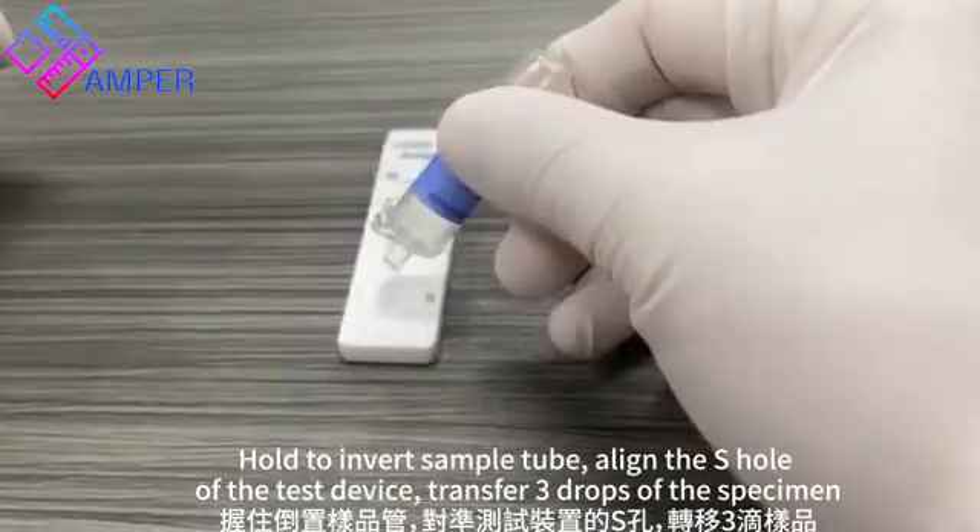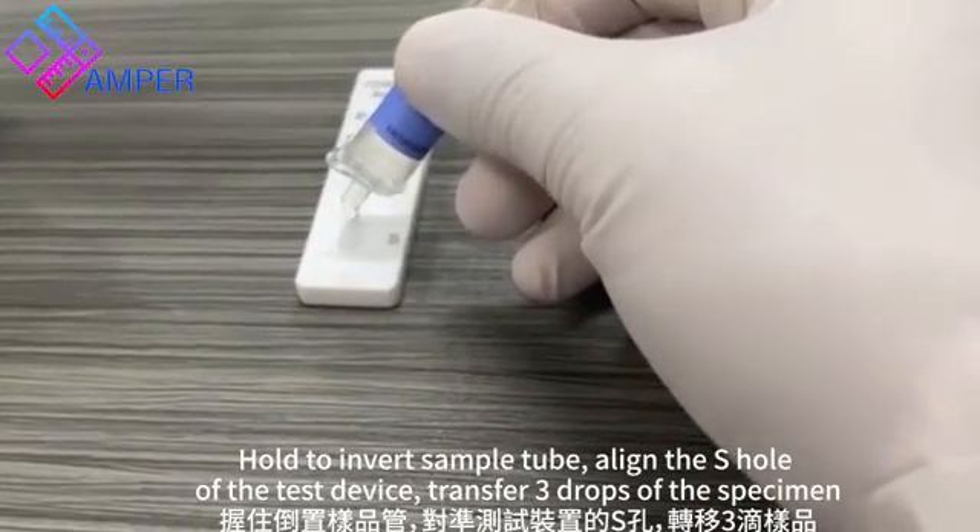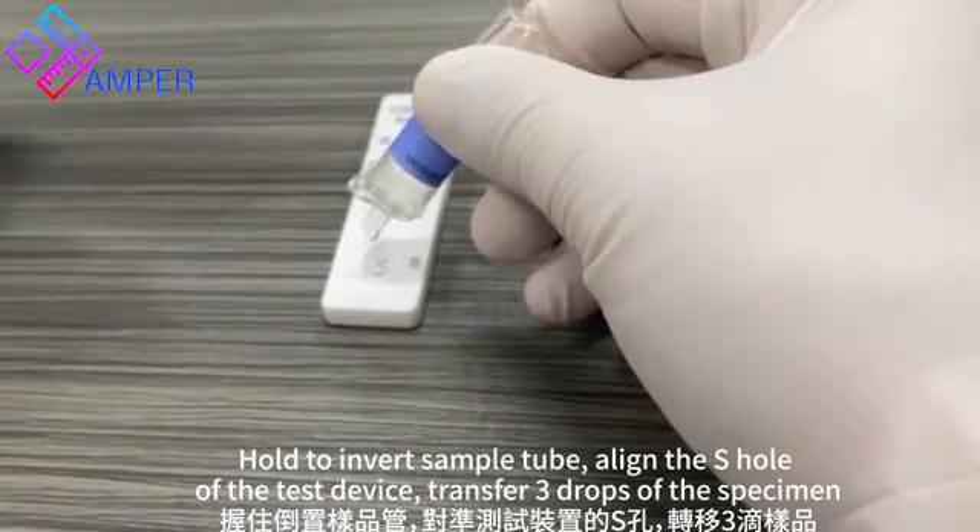Invert the sample tube and align the S-hole of the test device. Transfer 3 drops of the specimen into the S-hole.